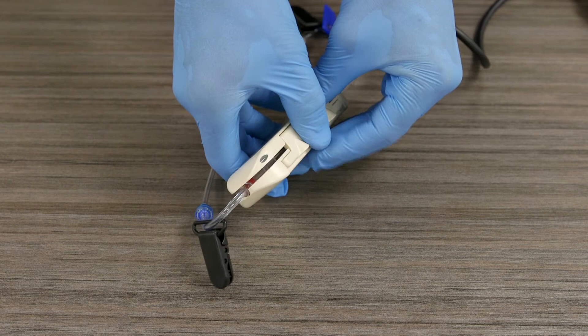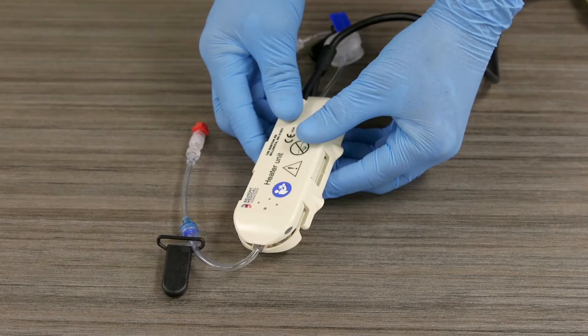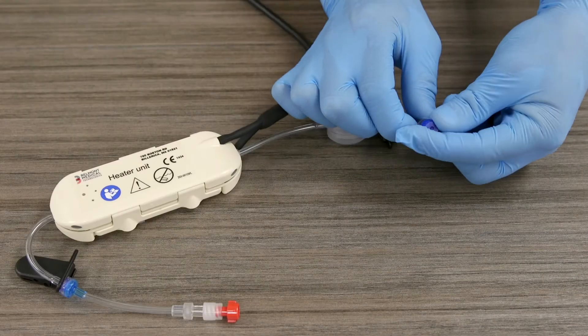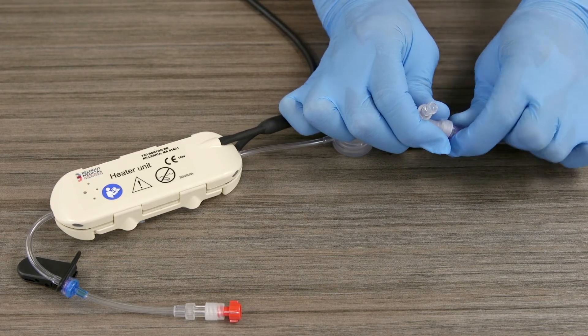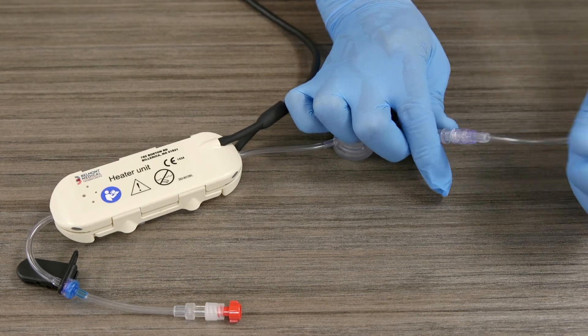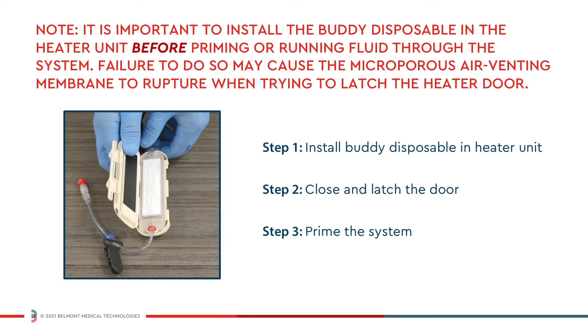Close and latch the heater door. Do not force the door closed. If the disposable is incorrectly positioned, the heater unit will not close properly. As a last step before moving to priming, disconnect the blue luer cap from the buddy disposable and then connect any administration set to that luer fitting. It is important to install the buddy disposable in the heater unit before priming or running fluid through the system. Failure to do so may cause the microporous air venting membrane to rupture when trying to latch the heater door.